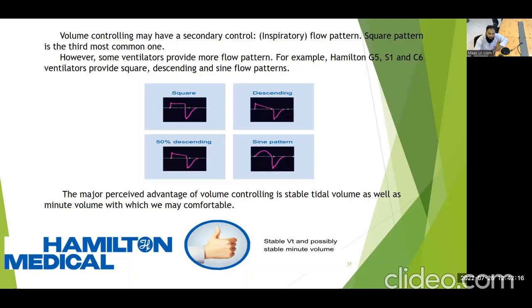Today, if a patient who is 5.5 feet has an actual body weight of 70 kg, after 1 month it will not be 70 kg, it will be 75 kg, or it can be 65 kg. So we cannot rely on actual body weight. For setting the tidal volume, we will rely on ideal body weight.